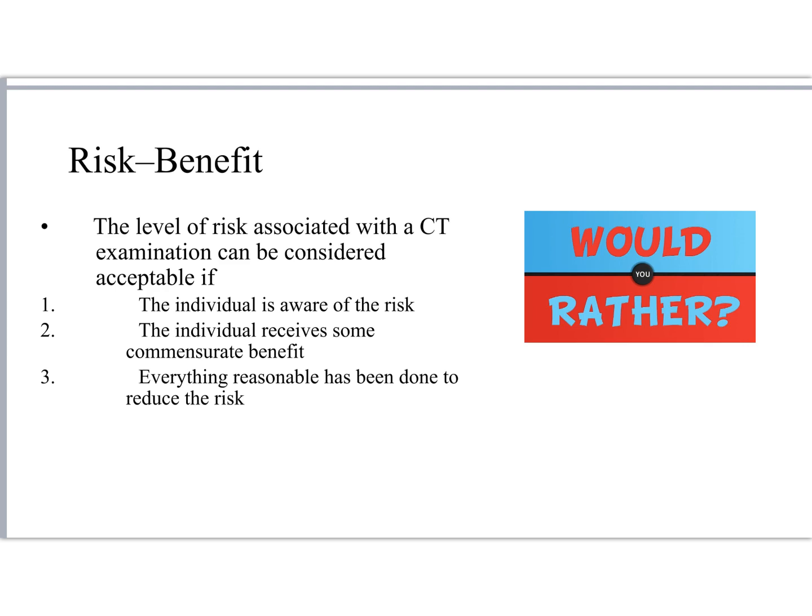I'm going to take every measure that I can as your CT tech to keep the dose to an optimized level. And what I mean by optimize is I'm not going to just turn the dose all the way down, because then the pictures wouldn't be good. I'm going to find a place somewhere in the middle where we can still get good pictures at a relatively low radiation exposure.